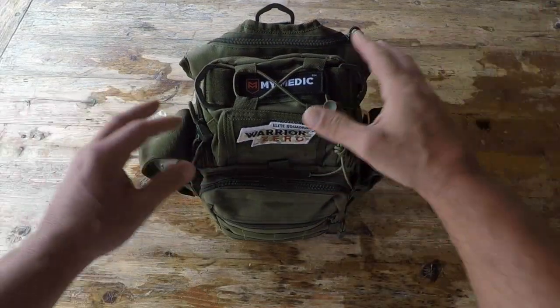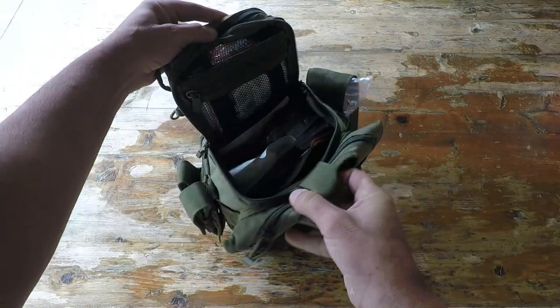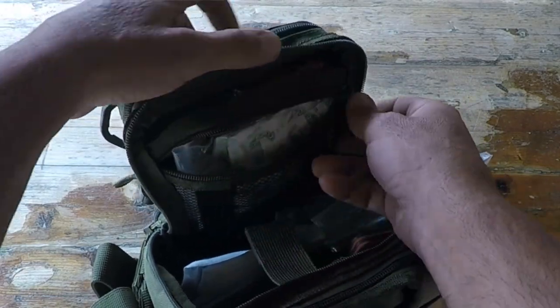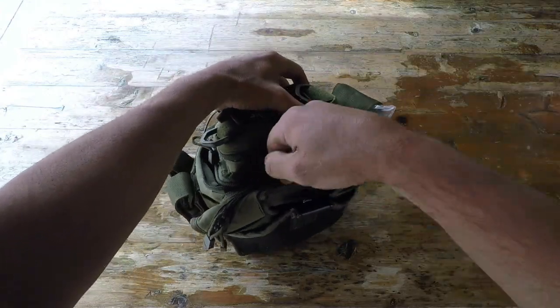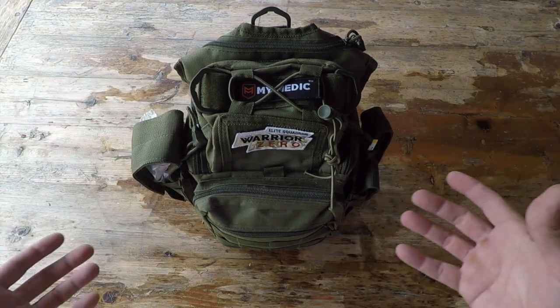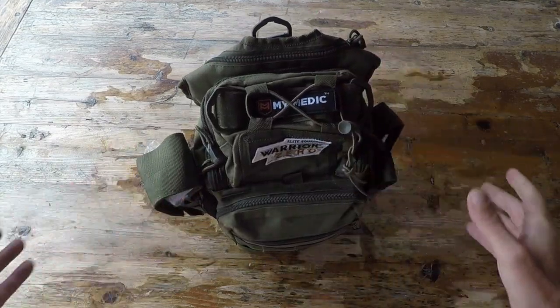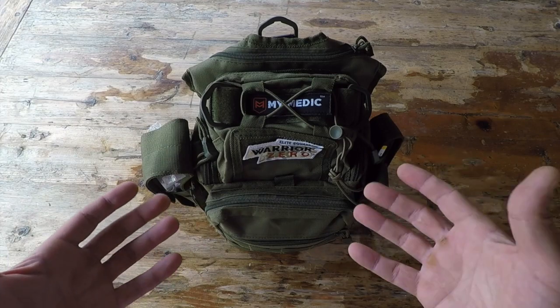So what is it about My Medic that makes them so different than everybody else? First off, the first thing that I noticed is the thought that was put into design. Not only is the pack itself super rugged and built the way that I would want — being able to access all the compartments, the way that the compartments were placed, the ease of being able to get to the actual content, especially when there's a scenario and your heart is beating outside your chest. You need to get in there quickly and access the contents that you actually need. So the design of this pack, the way that it was put together, is something that had me sold right from the beginning.